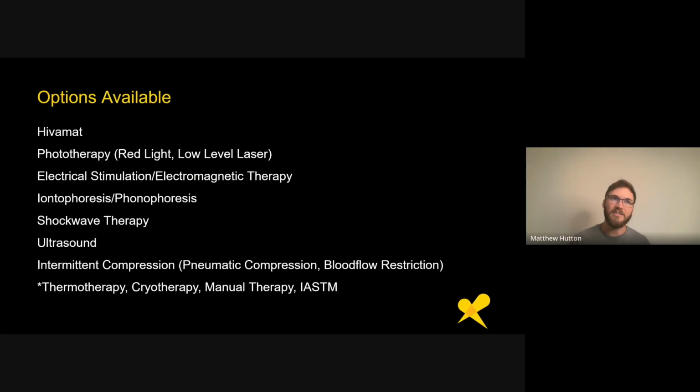At least in theory, I'd have to see the literature on whether it's actually more effective, following the body's natural rhythm. But the Normatec idea is that your body drains any kind of lymphedema through the lymphatic system, which has all of these one-way pumps. If it has a valve that's blocking backflow, you want to push it through the valve, and then the body won't let it come back down. So you're squeezing it out of the feet up into the calf, from the calf up the thigh, and it's draining ultimately in the stomach. You're trying to follow the body's natural return system.